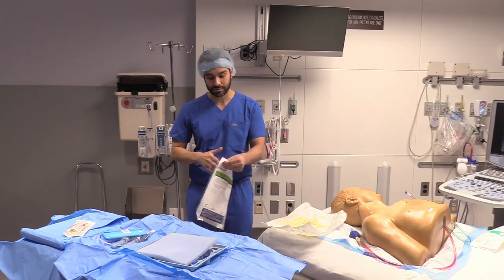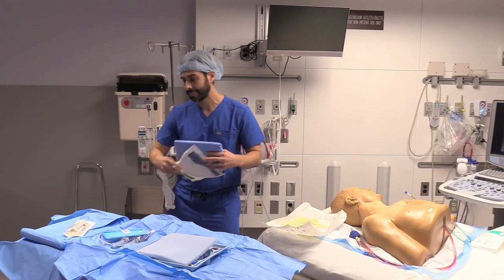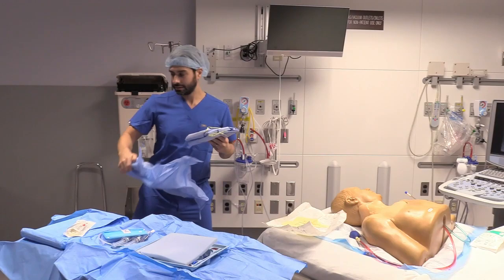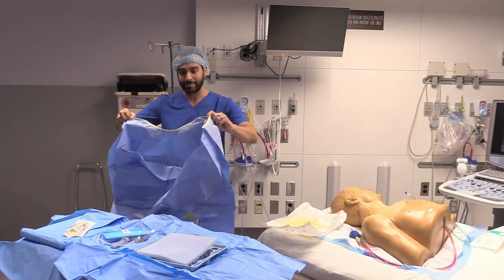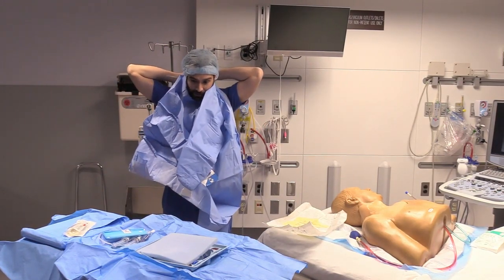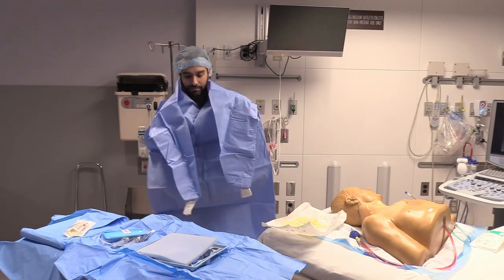Take my gown. And if you're by yourself, one thing that I do is you can grab the back here sterilely and put this on so it doesn't come off. If you have a colleague, then you can have them come behind you and place that for you. Place your hands through.